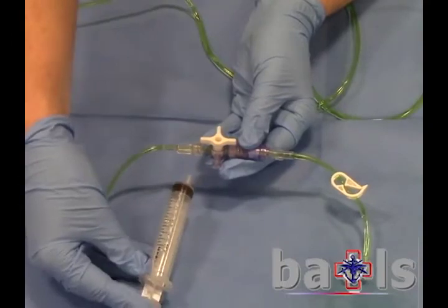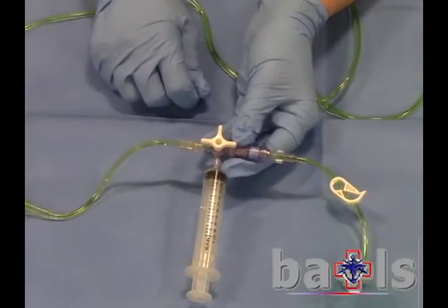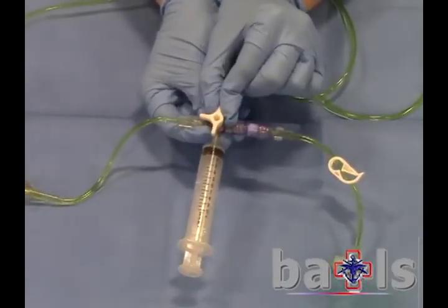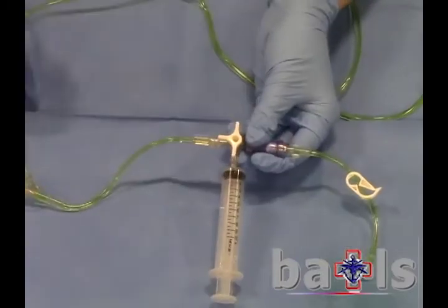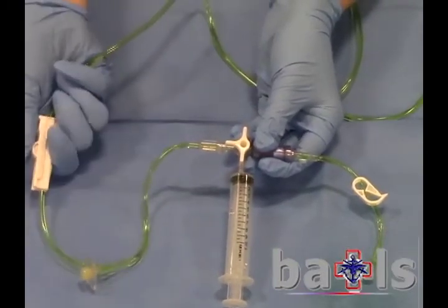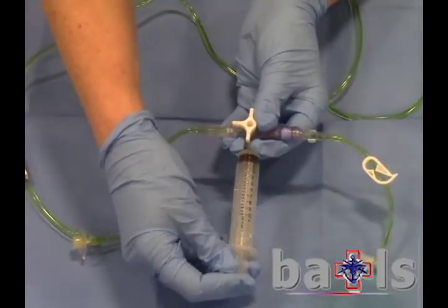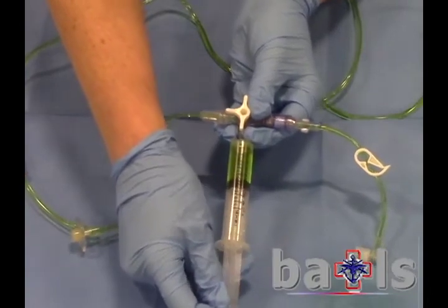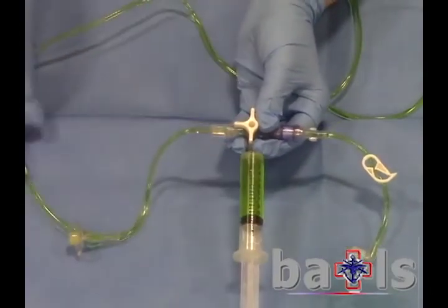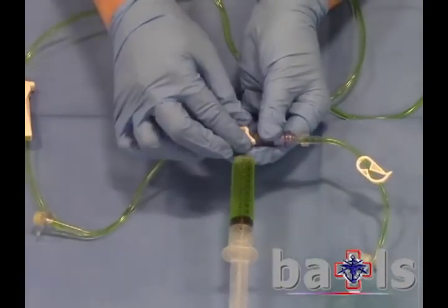To prepare a flush, attach a 10ml syringe to the remaining port and, using the 3-way tap, open the system to the syringe and to the bag. Unlock the giving set and draw up 10ml into the syringe. Lock off the giving set and close the ports on the 3-way tap.